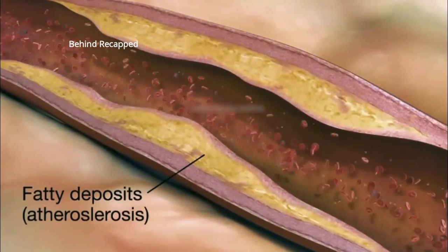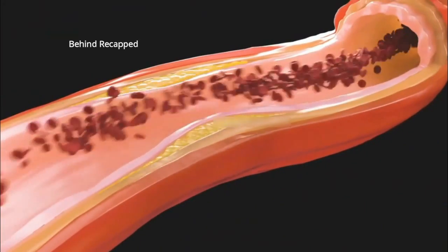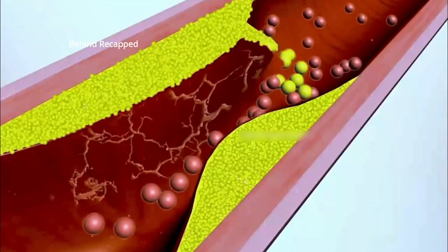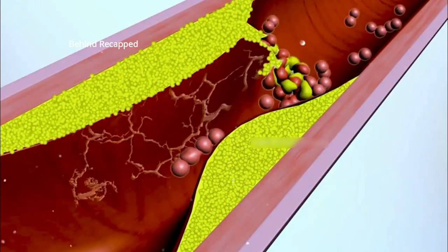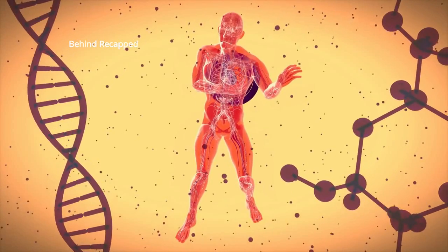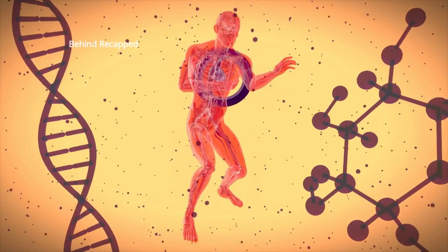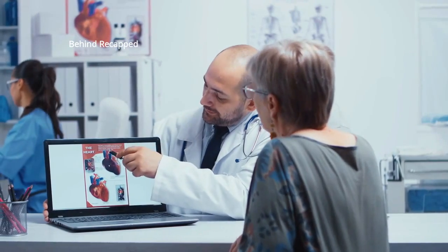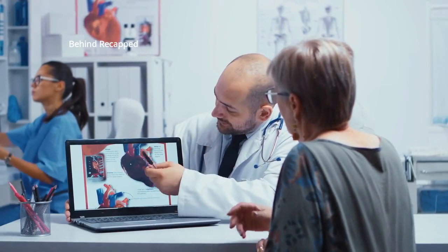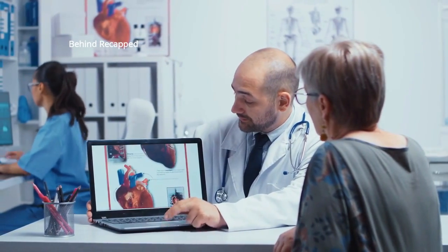In these situations, there's a buildup of plaque, or atherosclerosis, on the walls of the arteries. As plaque accumulates, the arteries narrow and can become blocked. In a heart attack, the plaque may also rupture, resulting in a clot that stops blood flow. Doctors perform more than 1.8 million angioplasties a year in the USA, according to the American College of Cardiology. Let us see how angioplasty is done.